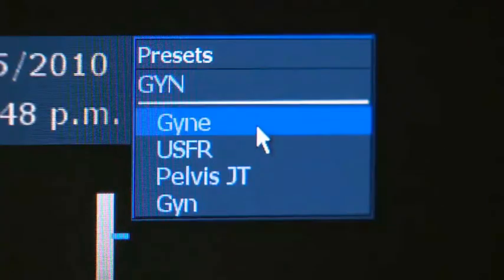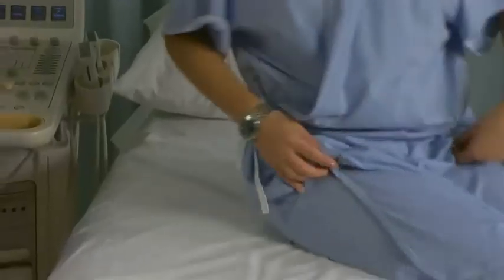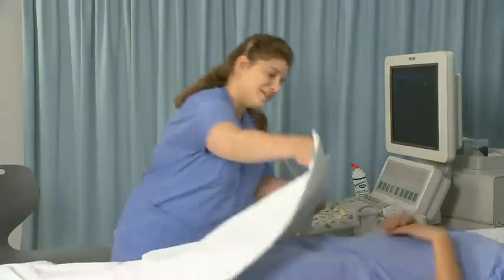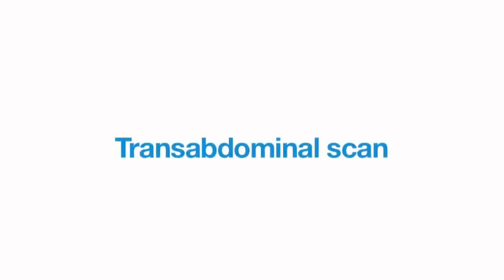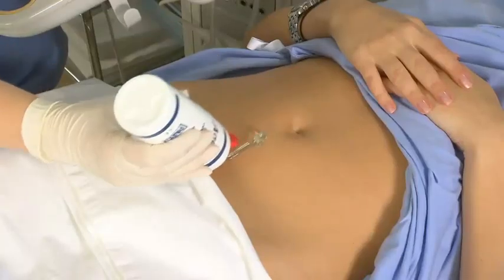Select the standard preset for a female reproductive system ultrasound. Ask the patient to lie supine on the examination table. Sit or stand on the patient's right side with the ultrasound machine on the upper end of the examination table. Expose the patient's abdomen and apply gel on the midline just above the symphysis pubis.